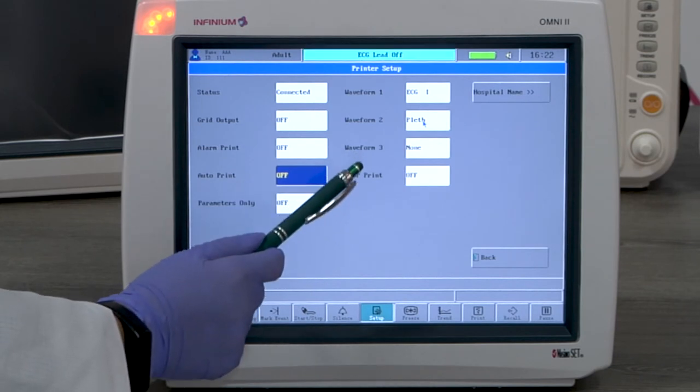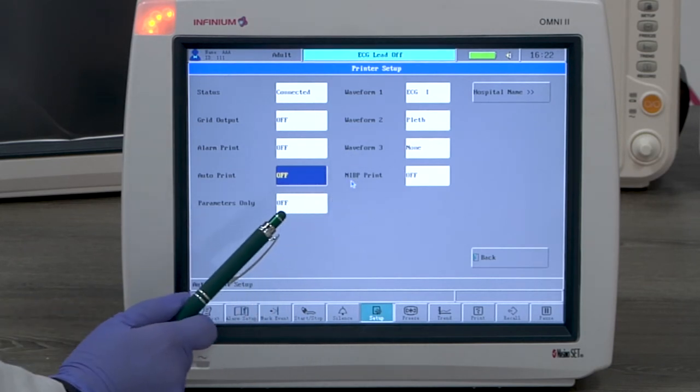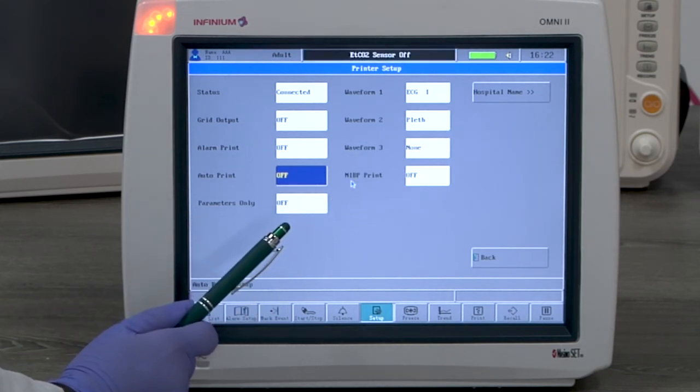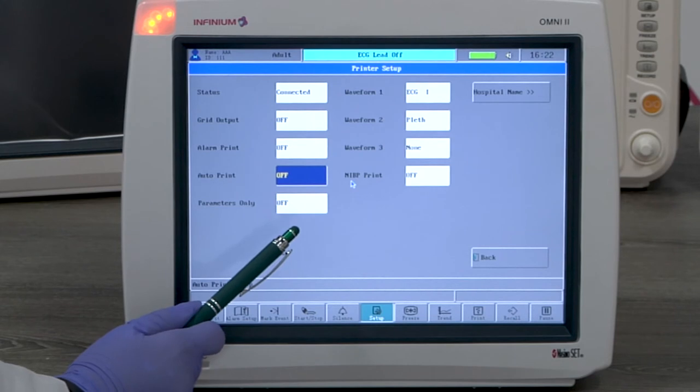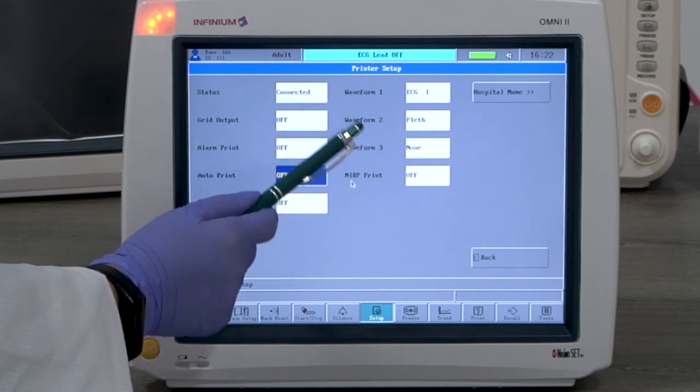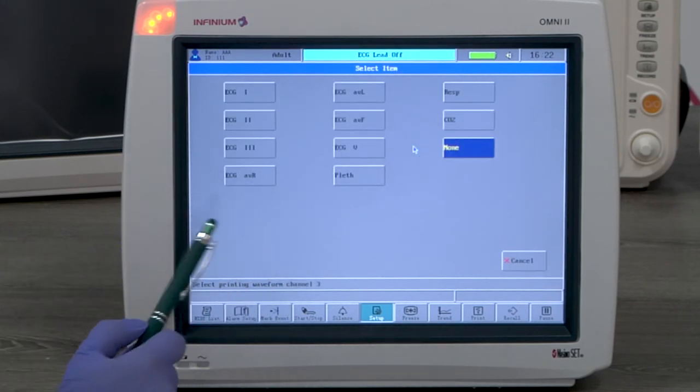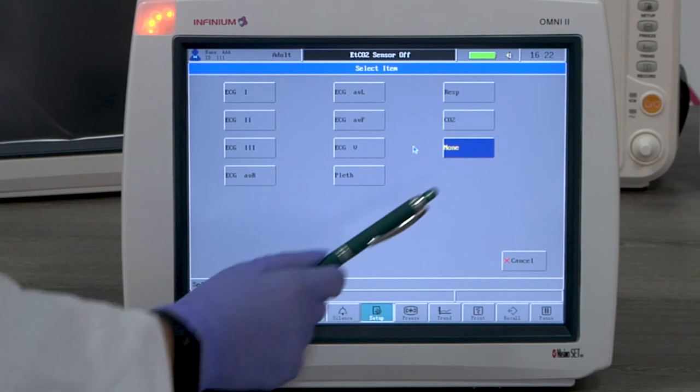NIBP print, if on, prints automatically when there is an NIBP reading generated. Waveform 1, 2, and 3 are the selected waveforms to be printed.